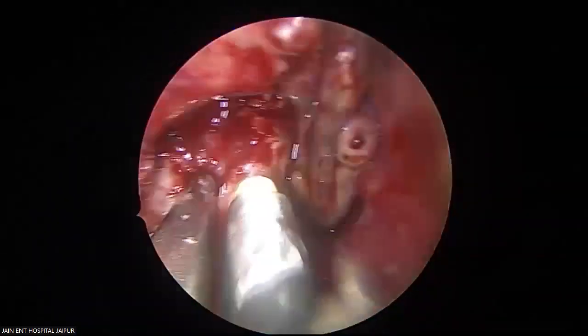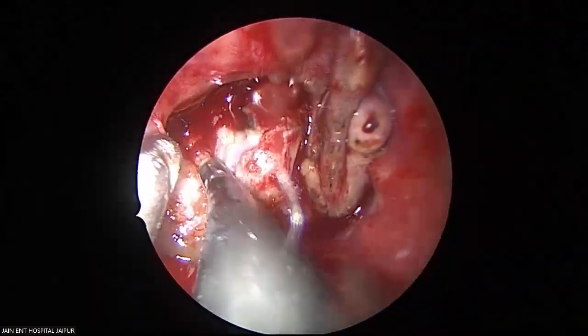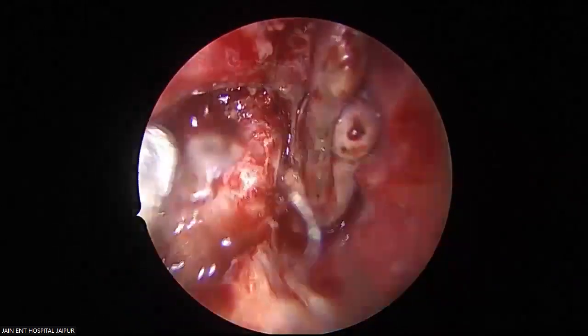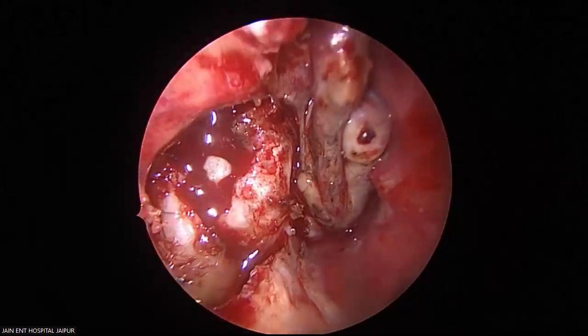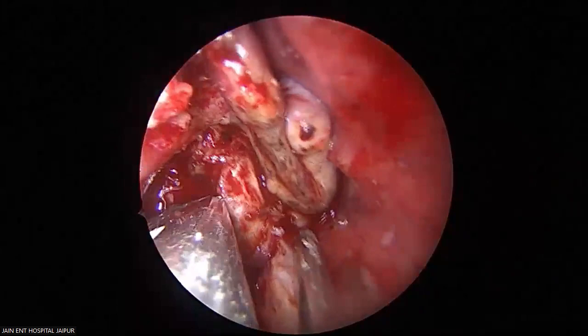See the periosteum there behind? Yes. I can coagulate. See this to make my life better. That's the beauty of coagulator. Very good. Now I can take the help of bone punch, this Kerrison punch.